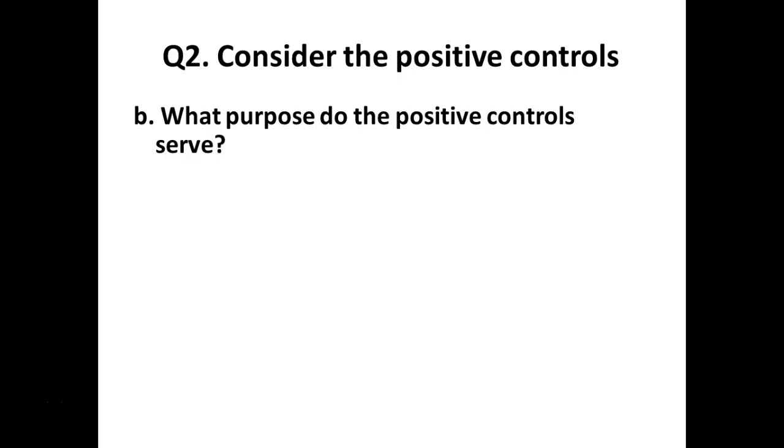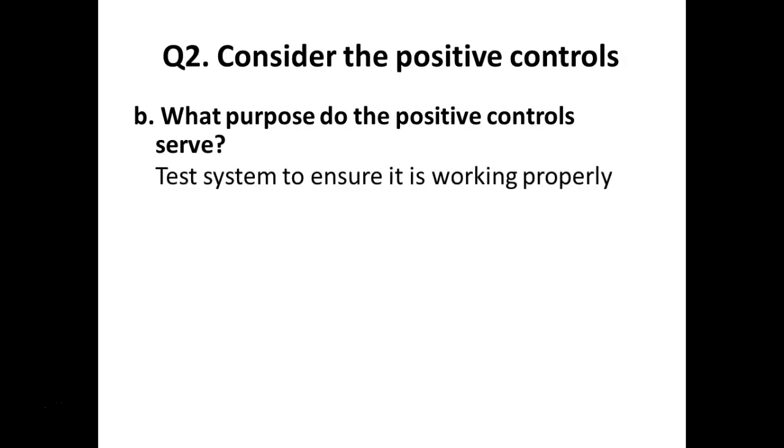This is a highly specific test and sensitive test. So if it is showing positive, you are pregnant. Don't do like Juno did and go get 6 more. They're all going to come out positive. Figure out what you're going to do about it being positive. Can you get a negative result, though, and still be pregnant? Yeah, because, again, it's really good in sensitivity, but it's not going to detect really tiny amounts. So negative isn't sometimes a negative. It depends on the sensitivity of your test.